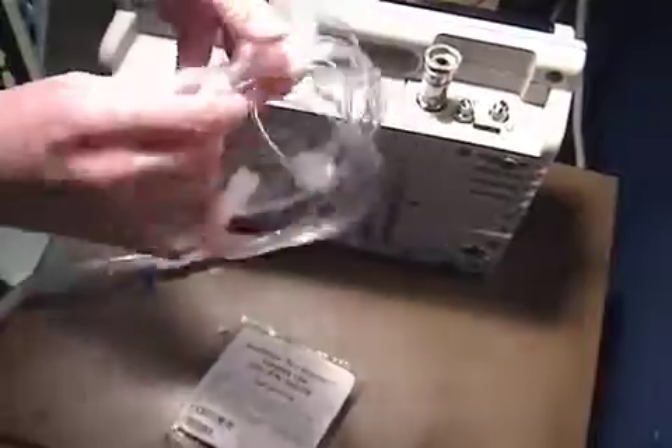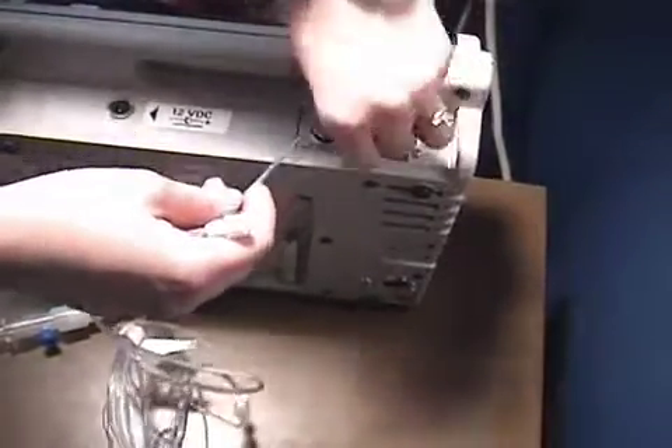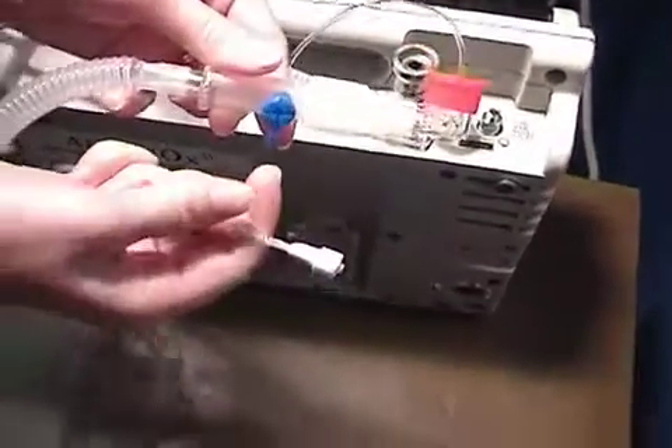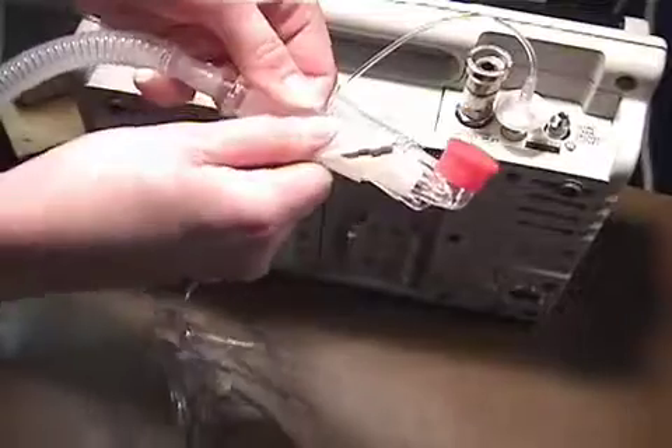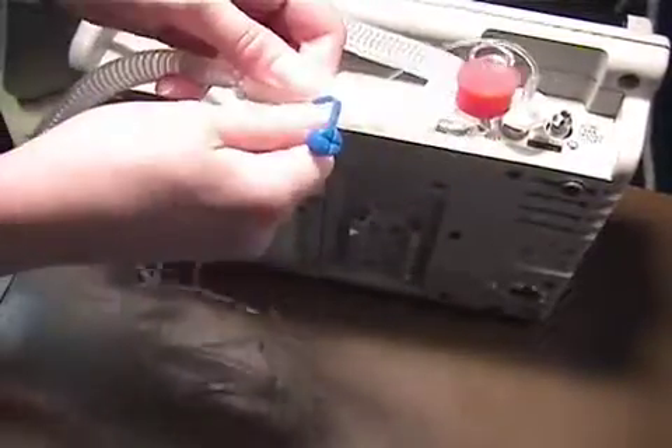Next, remove the sample line and place the filtered end into the sample port on the Aranox unit. Then place the drying end of the sample line into the sample port on the circuit.